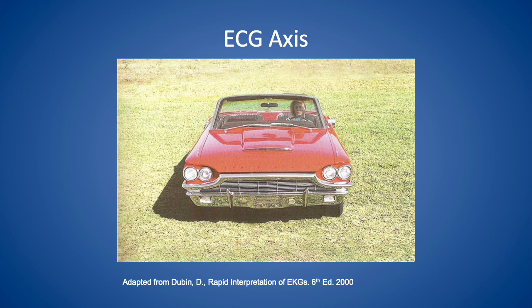A typical wave of depolarization is positive charges passing through the myocardial cells. And so when that depolarization happens, it moves towards the positive end of that electrode. If we see that moving in the same direction, we should see an upward deflection of the EKG. And if the depolarization is moving away from that positive electrode toward the negative electrode, we should see a downward deflection.